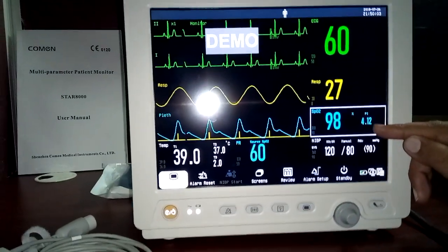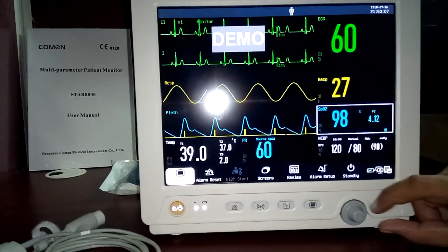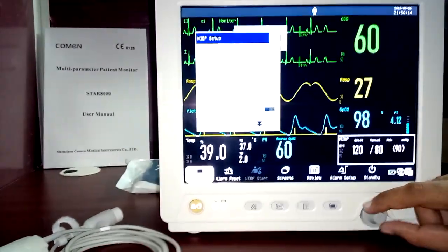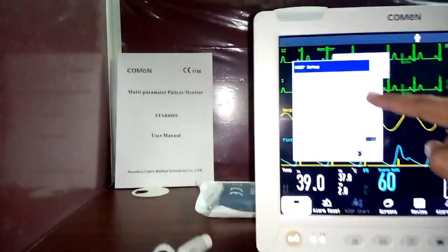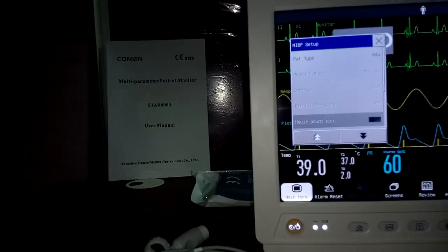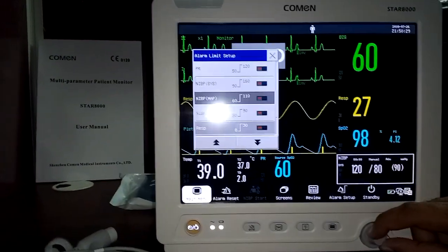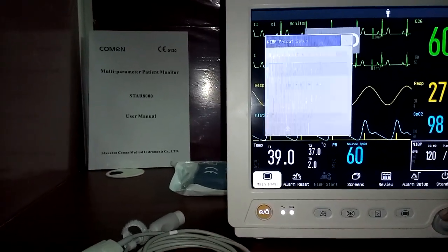In the NIBP menu, you can switch between automatic and manual measurement modes. The monitor is in demo mode so changes cannot be applied right now. All alarm limits for any parameter can also be adjusted from the individual parameter menu.